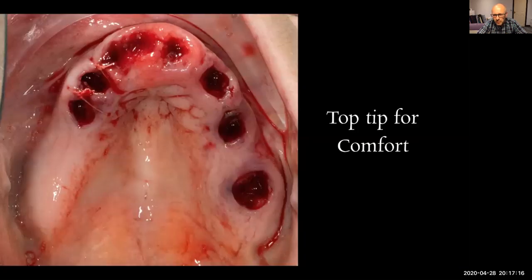It's lovely. So now I just want to share with you a couple of tips. So when we have the patient, if we go back to the extraction visit and the fit visit of the denture, I want to make that denture as comfortable as possible. And when we've taken the teeth out, it's so easy for the denture to rub. It tends to rub in these buccal areas around here, in that sort of undercut area.